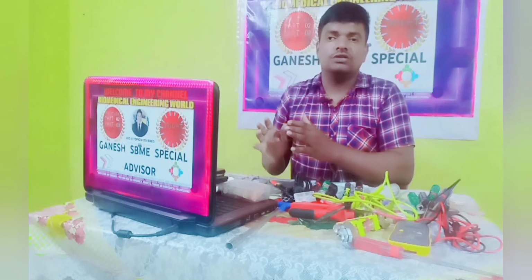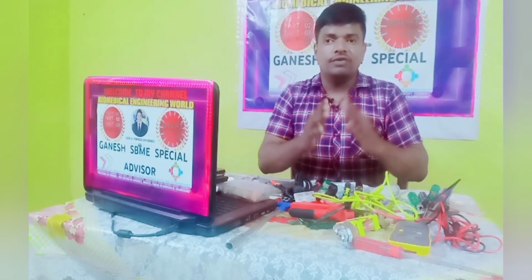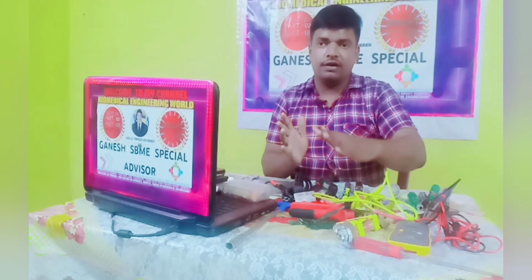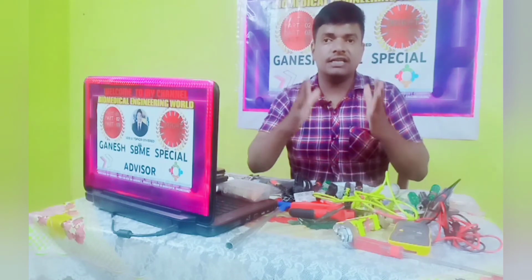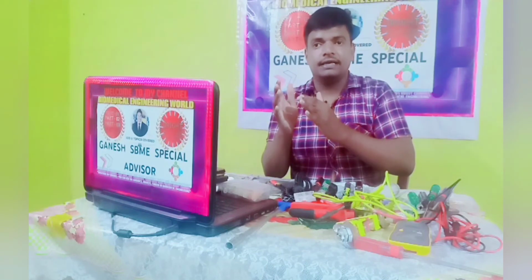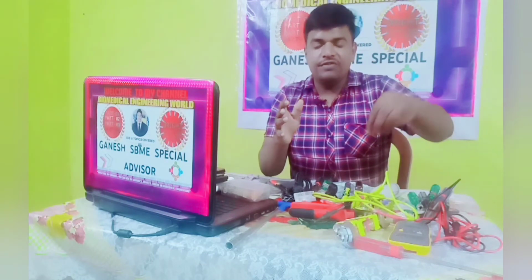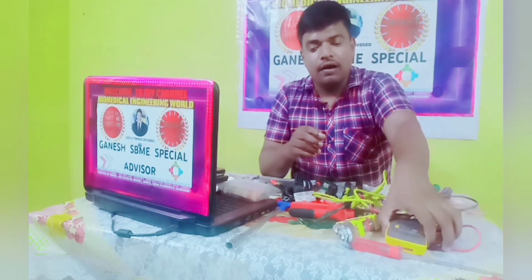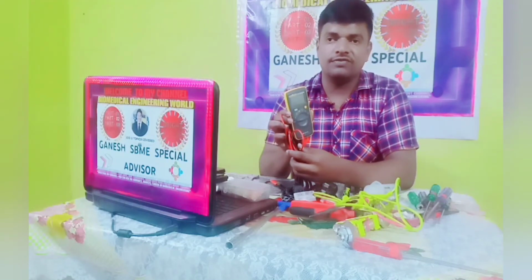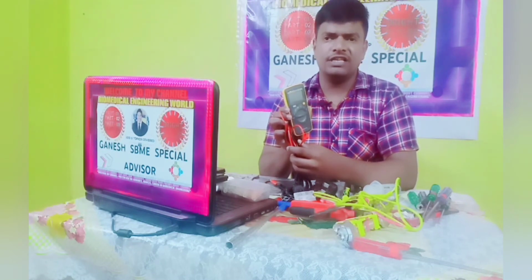But if all these things are good and the machine is still not working, then in that situation we need to check the fuse, and check the power supply and indicator one by one. If everything is still not working, then we need to open the monitor, check whether the inside components are good or bad, and check the physical condition. Next we check the power supply to every component by giving 230 volts AC. Then by using the multimeter we can check the ratings of all components and whether components such as resistors are working or not, based on the electronic components in the medical devices.